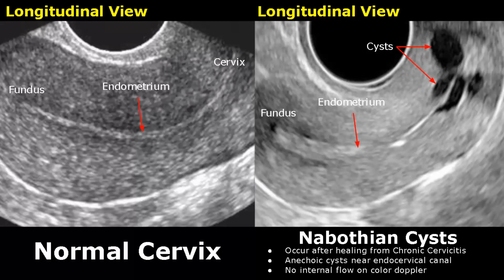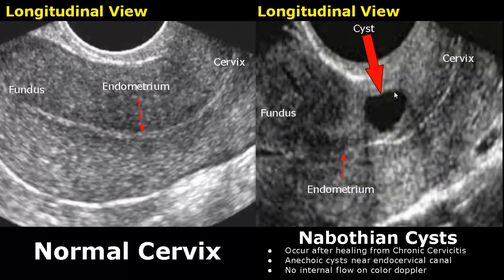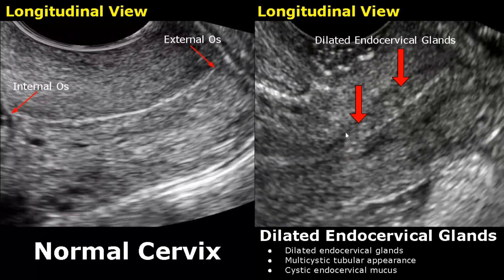We can see three cysts here. Here is another image showing a single Nabothian cyst near the endocervical canal. Dilated endocervical glands will have a multicystic tubular appearance. This appearance is also called cystic endocervical mucus. You can see a difference in the appearance of the cervical canal.